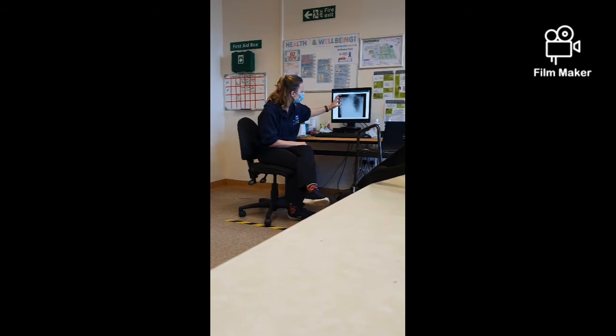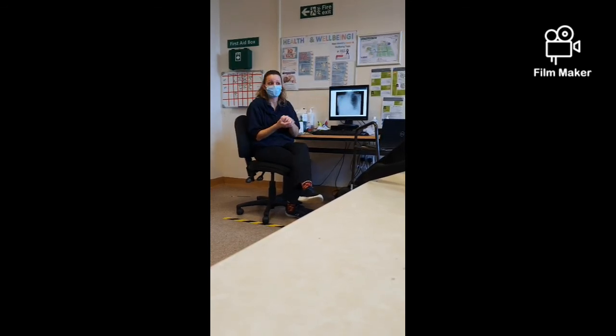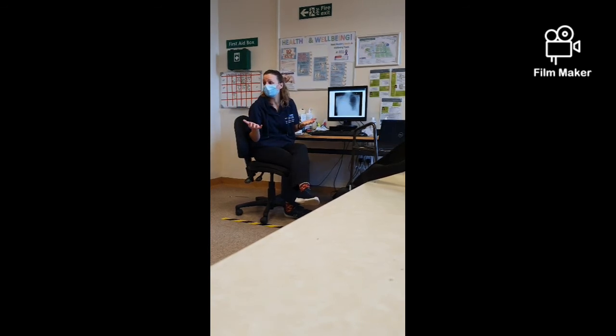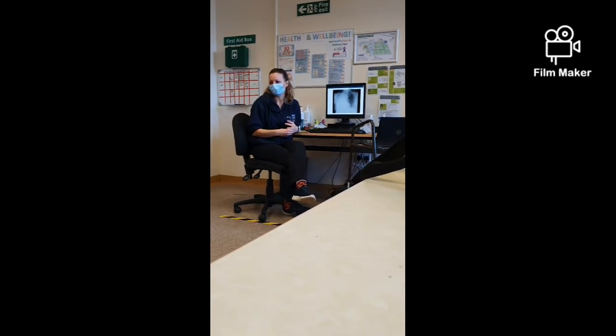So there are many reasons for a collapse. It could be a mucus plug that's blocked the airway and the lung collapsed. It could be, you know, a severe pneumonia. But what's happened is that the lung collapsed, and as the lung collapsed, it's drawn everything across, okay? So as that lung collapses, it draws everything across. And obviously it's white, and it's white because we're not getting what in it? Yeah. Air. Okay. Any questions? Is everyone happy with that?